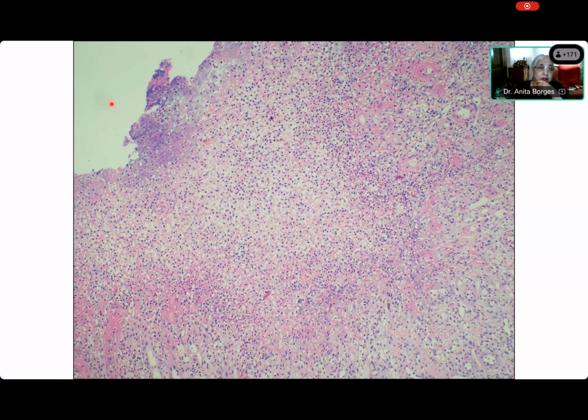Gosh, there are a lot of enzymes in your saliva, and they digest whatever is there in the floor of the ulcer. Okay. Then you have another layer, which is fibrin. You just see the network, it is fibrin. And in that fibrin, there are neutrophils that are caught up. Then comes a third layer. You can see these layers so beautifully.